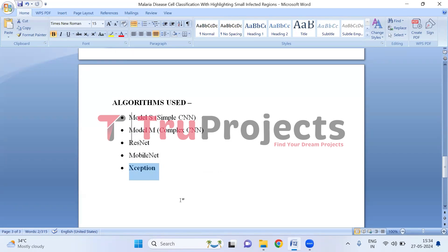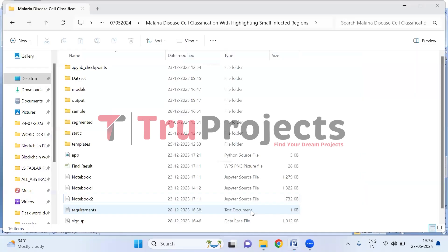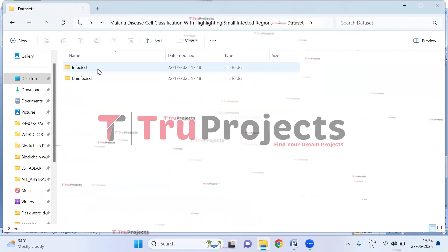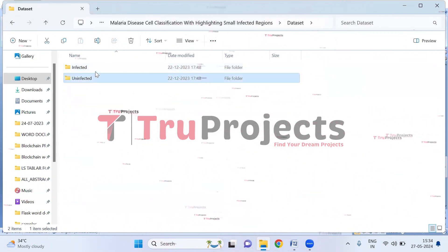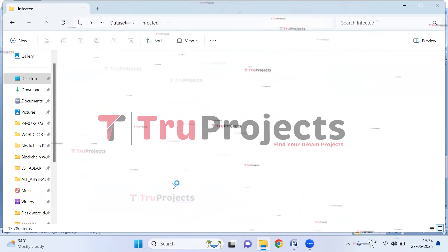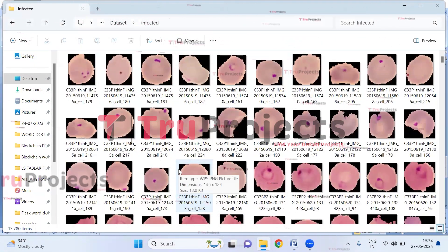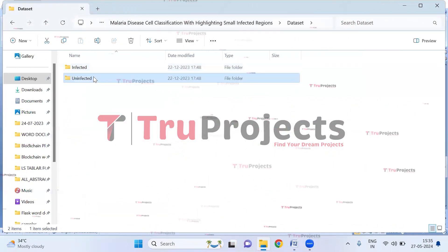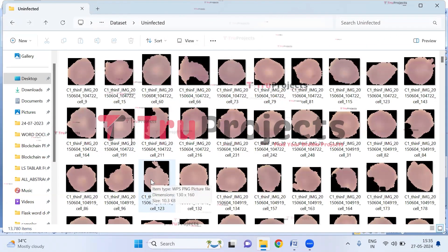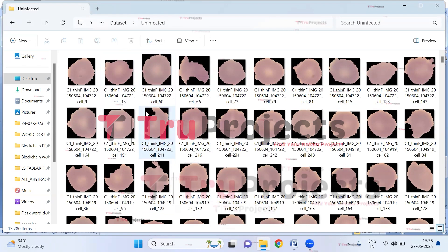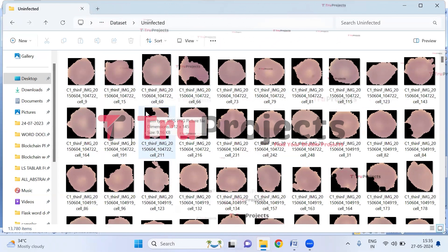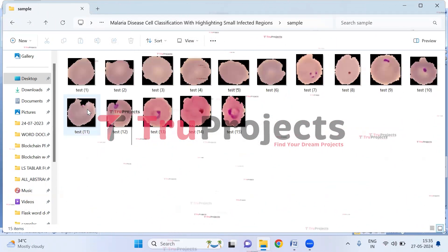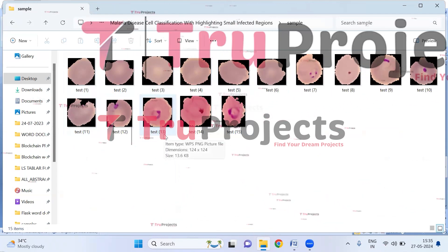Now let us execute the project. To execute this project, first we need to open the code folder which contains the project source code files. This is the dataset folder. In this dataset folder we have two sub-folders named 'infected' and 'uninfected.' The infected folder contains infected red blood cell images used to train the model, and the uninfected folder contains non-infected red blood cell images. These images are crucial for training the models to distinguish between malaria-infected cells and healthy cells. There is also a sample folder containing test cases which we will use during the execution.